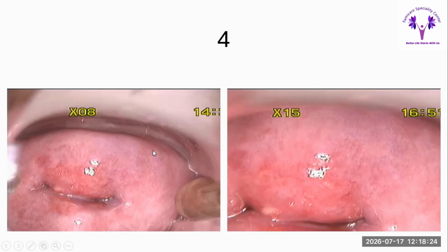Again, just to show you the type of cervix, you can see that this is the neosquamocolumnar junction, and the cervix is very dusky because of the infection. There are a few Nabothian follicles seen here. If you can make it out, the transformation zone is type 1. Here is the Nabothian follicle inside the columnar epithelium. So this area must have undergone changes earlier also. That is why the Nabothian follicle is present here.